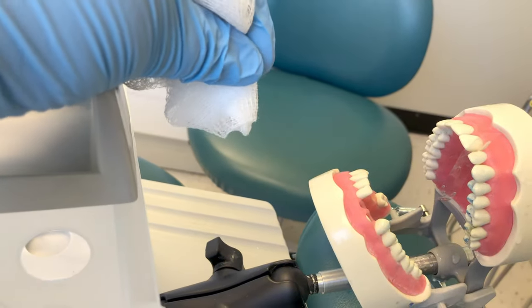Composites are placed in layers, so the doctor will want the packable material back. Ready the gun, take away their instrument, and deliver the material back into their hand. They'll place another layer; then hand the composite placing instrument back. Be ready to wipe the instrument and have the bonding agent handy so the doctor can dip their instrument. They'll place and shape, we wipe, they dip — repeat as needed.